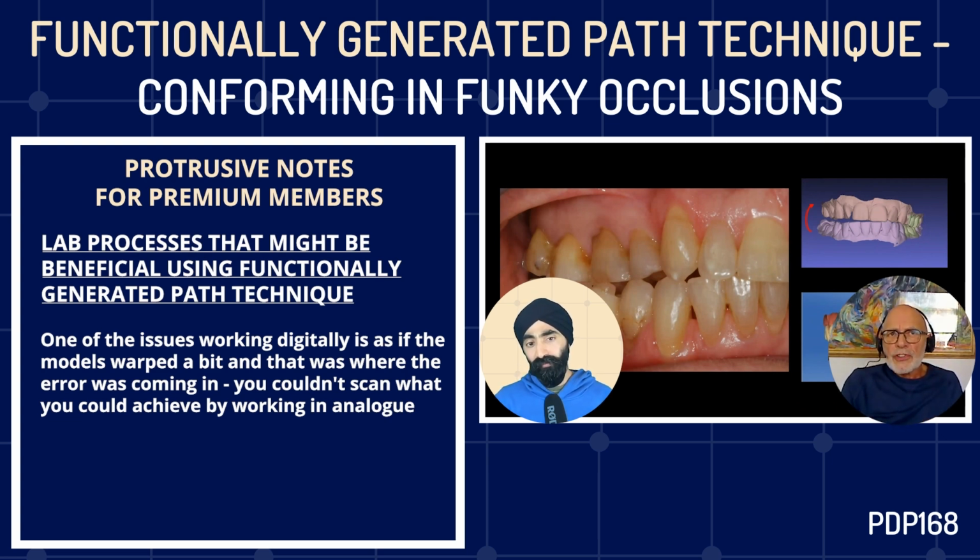And one of the issues about scanning is that there was a wonderful dentist called Andrew Keeley up in Leeds, who I saw presenting a small half-hour presentation on errors in scanning. And he was showing that there's a tremendous error in cross-arch scanning. I believe that a lot of that has been resolved in the very new scanners now. But at the time that we're talking about, there was a tremendous issue. And effectively, it was as if the models warped a bit, and that was where the error was coming in. So you couldn't scan what you could achieve by working in analog. So that was the challenge that we had.